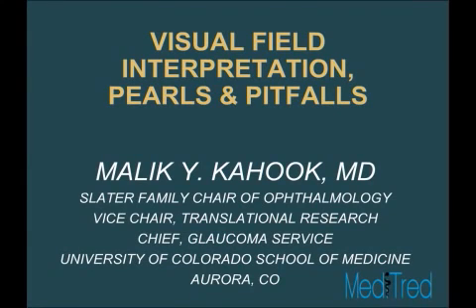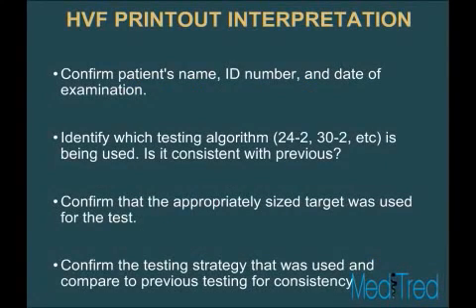So we've heard a lot about basic Humphrey Visual Field, the standard automated perimetry that's performed, as well as some of the more novel testing like SWAP and FDT. What we'd like to do at this point is bring everything together with a few pearls for practice. If you're coming back to this course, you can fast forward to this last part and get a quick overview of some pearls for practice, and hopefully you can see that it's a tie-in to the previous two talks.